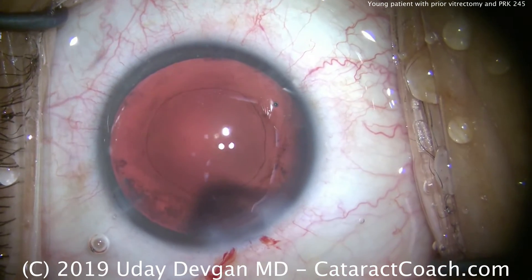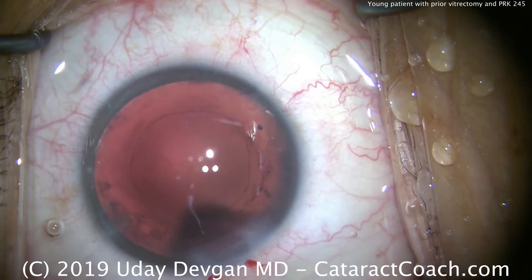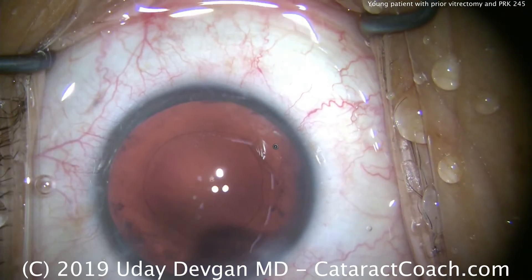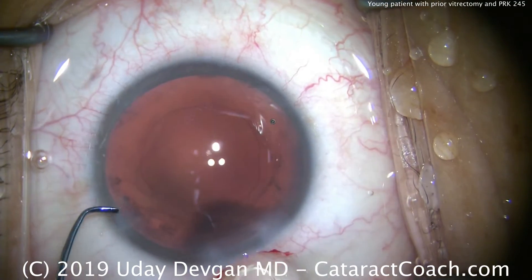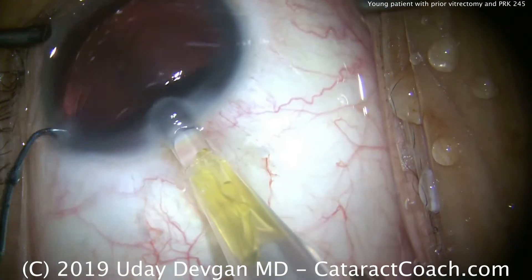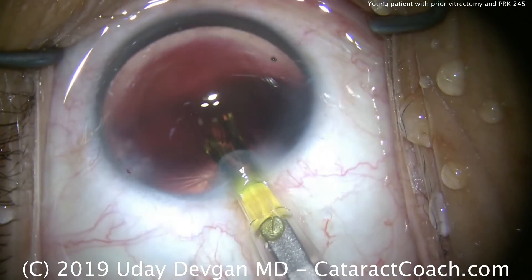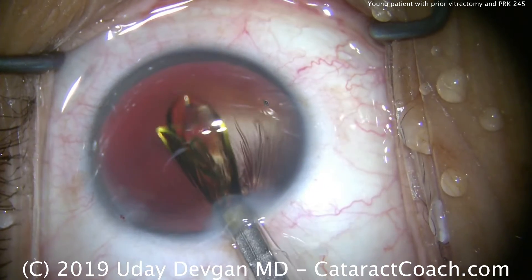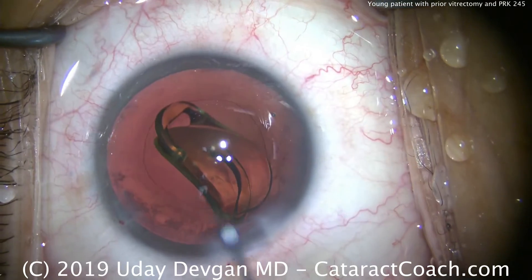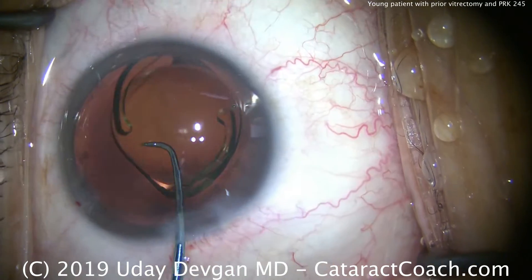Here's the empty capsular bag — you can see the outline of the rhexis, which looks great. We're using a single-piece acrylic lens aiming for a plano outcome. It's a little tight because of the smaller incision, so we'll use the wound assist technique. The tip of the injector just abuts the main incision without going inside the eye, and the lens is delivered inside. This way we keep our incision smaller than normal.